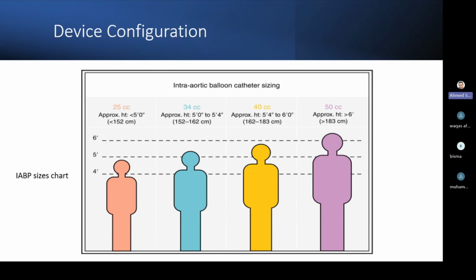Definitely. So really, the size of the intra-aortic balloon affects the performance of the intra-aortic balloon. It should be appropriate, it must be. Yeah, I just want to remember the alarm. I took a screenshot of this one. This is important. Anyway, we are really looking forward to the troubleshooting session.